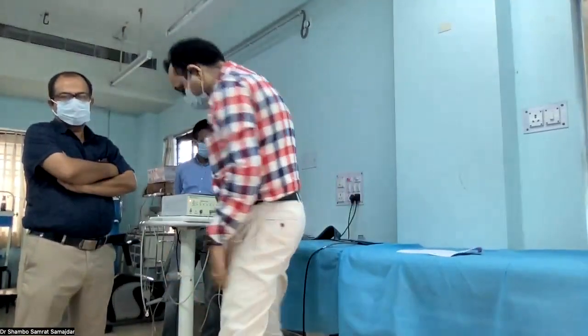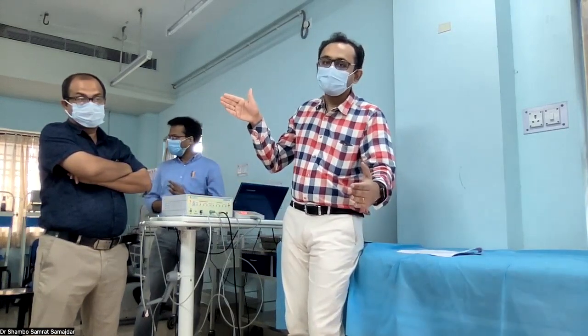Why? Because when we are talking about postural hypotension, it means the feet should not touch the ground, so the weight should not have any confounding elements. If I am standing, then our muscle reflex will take care and influence the blood pressure fall. So when we are talking about orthostatic hypotension testing, it is okay to stand on the ground. But for postural hypotension, there is a specific bed by which we can tilt the patient, known as the head up tilt table test. If we use that, the feet will not touch the ground, and that time we call it testing for postural hypotension.